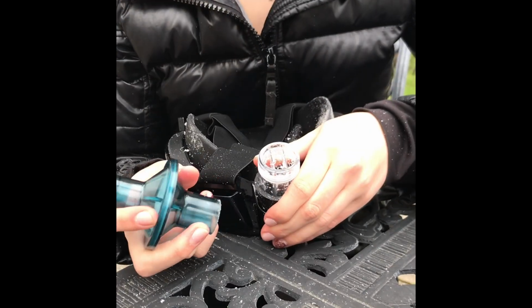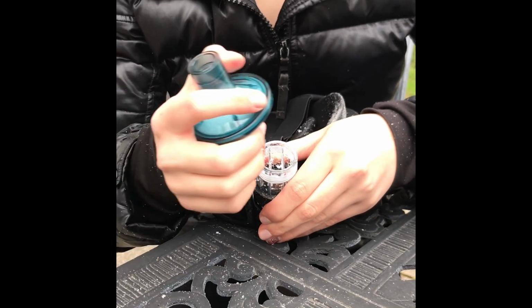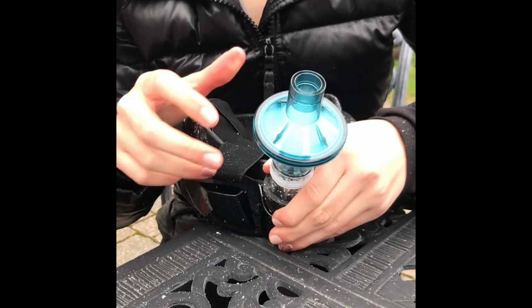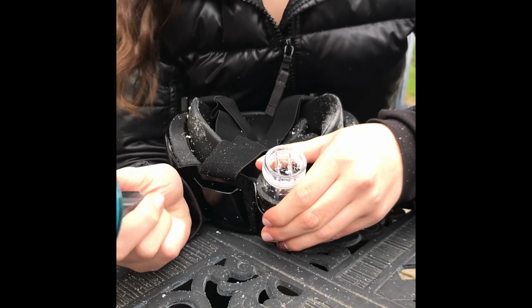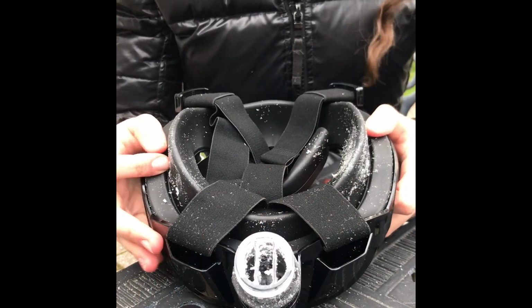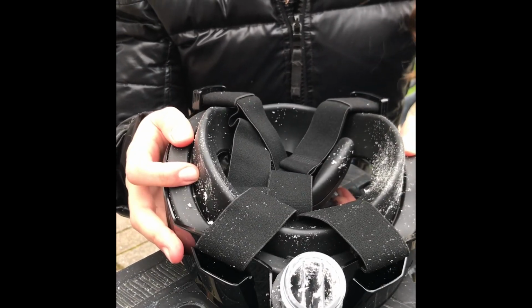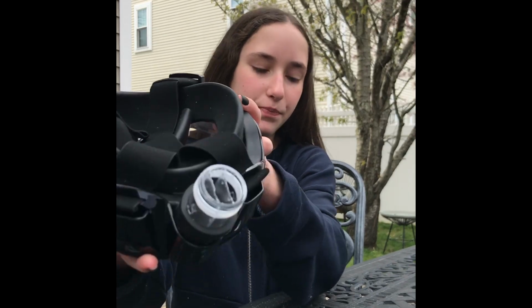Once you finish drilling, you're going to want to make sure that the filter fits properly in the top of the mask. In this case, it does fit properly. However, if it does not, just drill a little bit more to make sure that it does fit. Once you're done drilling, the mask is likely going to have a lot of plastic on it, so you're going to want to wash it off before you use it. Once we've washed out the mask, this should be the final product.